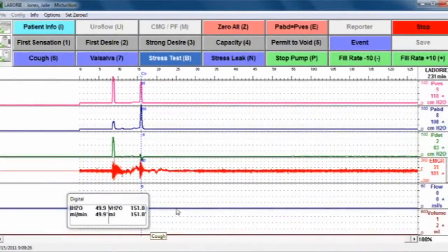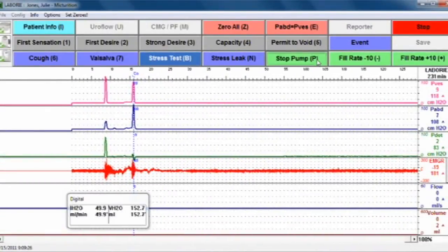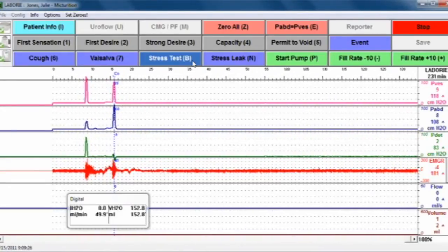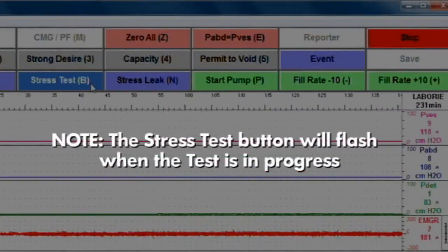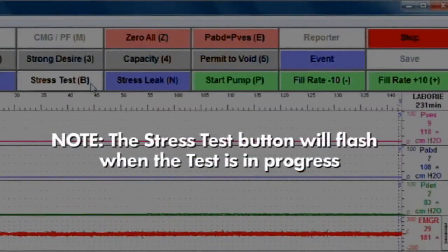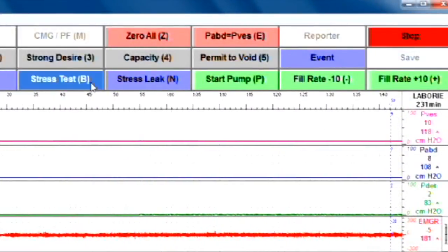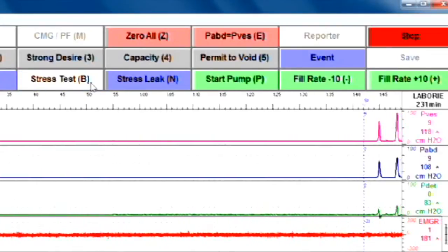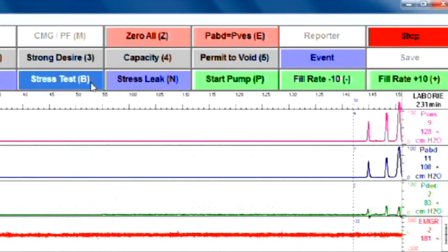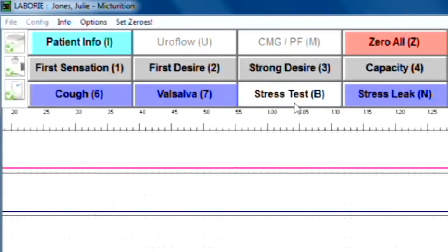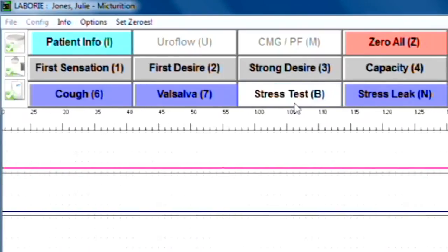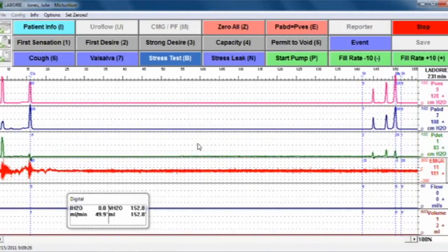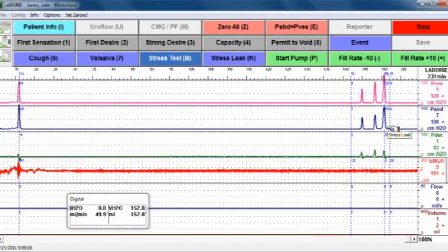Capacity is when they no longer can hold any more in their bladder. Once the patient has reached a capacity of about 150 cc's, you will hit stop pump. You will hit the stress test button and ask the patient to perform a series of three coughs. If stress leak was not marked, it will ask you if there was a leak. By saying yes, it will mark a leak on the biggest spike during that test.